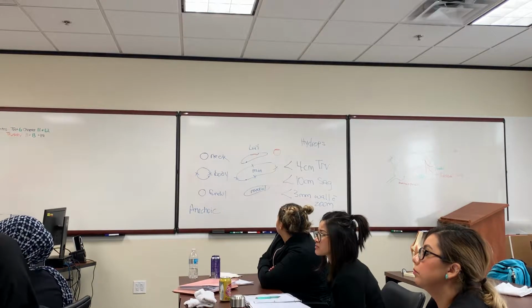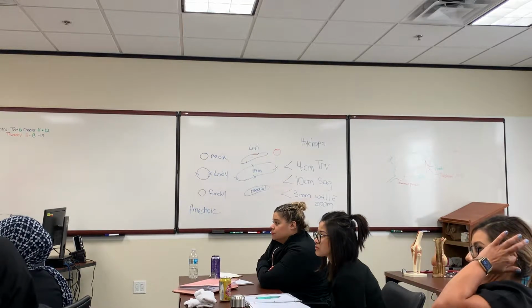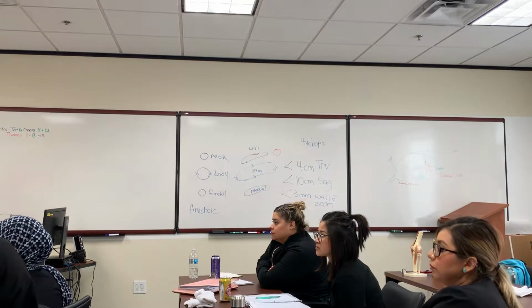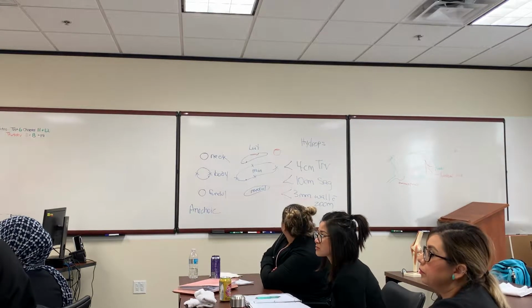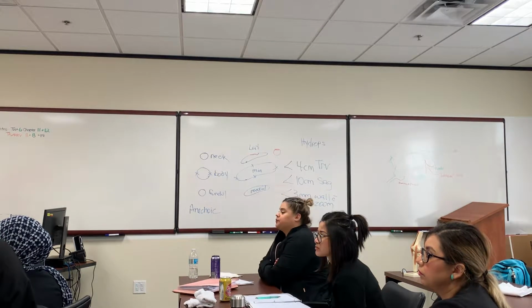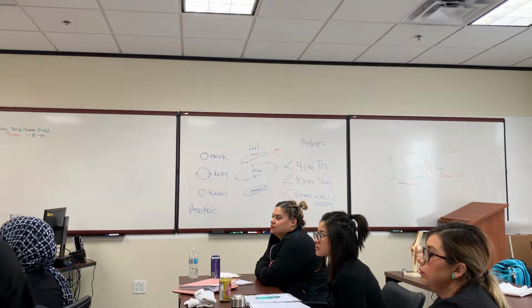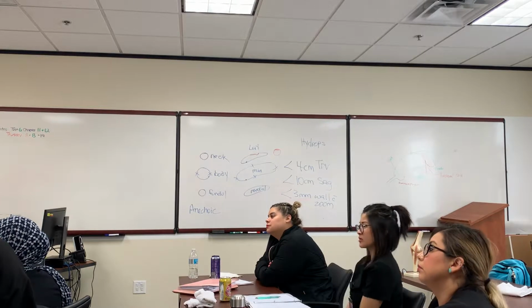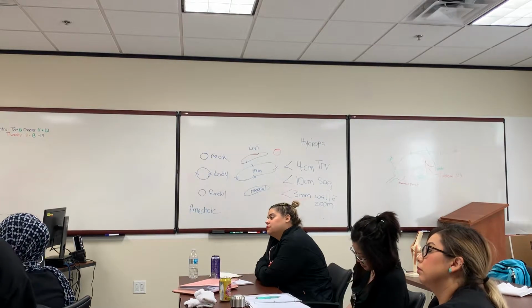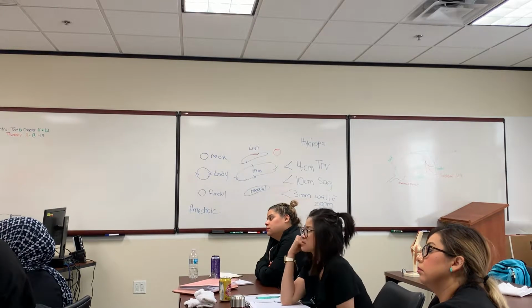Because what's happening? I'm breathing when they're breathing. So I know how long they've been holding their breath. Okay? I'm talking to them. They don't want to interrupt me because that's rude. Because we're brought up that way. When someone's talking, you don't interrupt them, right? So if you're constantly talking, you're holding your breath at the same time they're holding their breath. You're conversing with them, and they don't have time to ask you any questions.